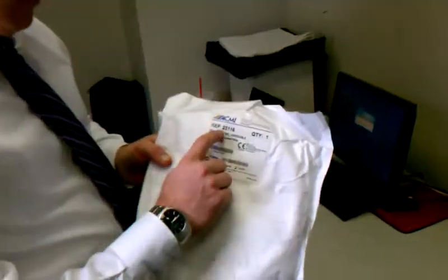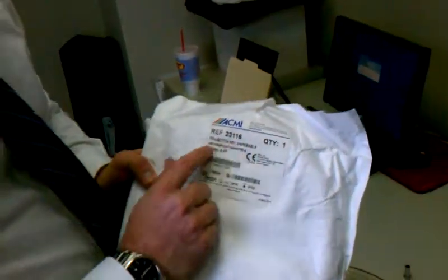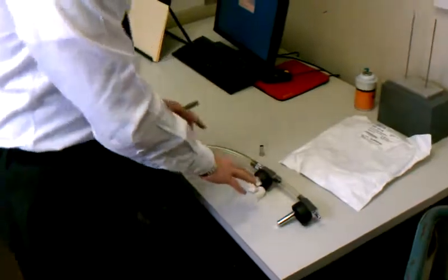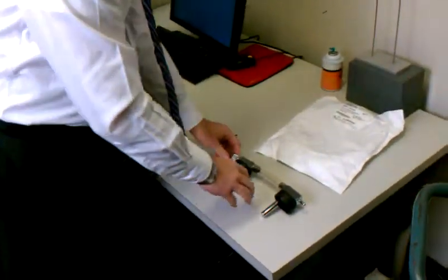We've received the Acme 23116 tubing, and I'm going to demonstrate how to adapt our bottle setup so that it will fit onto this tubing set.